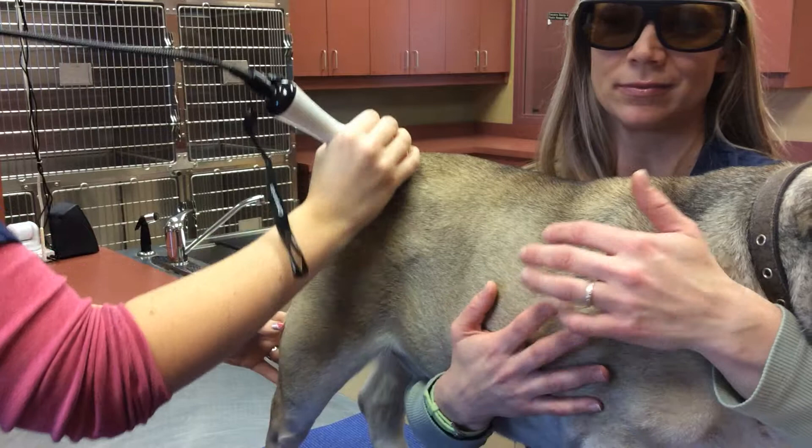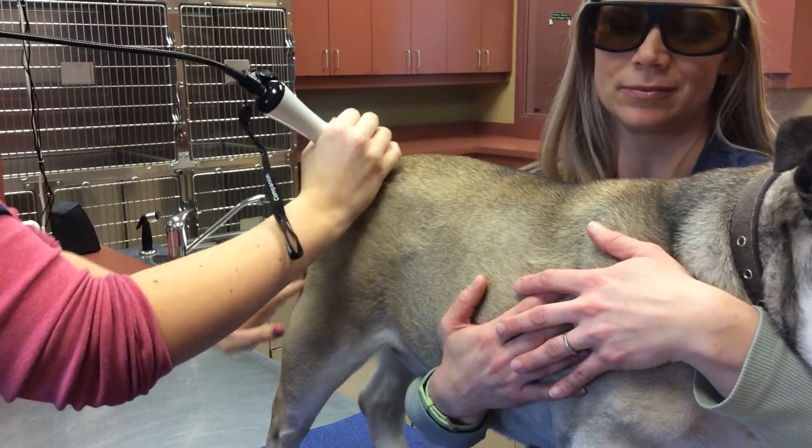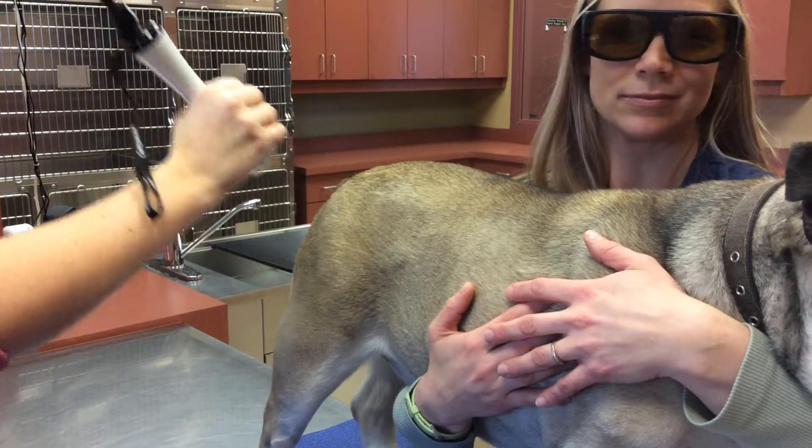She doesn't really feel this — it's just a little warm to the touch. And once we are done, stop.